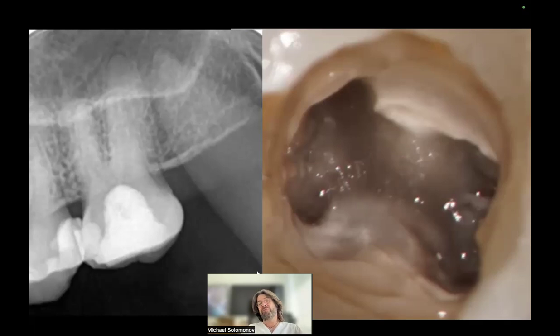The reason for referral was a problem with mouth opening, very limited, about 22, 23 millimeters. This is why the patient was referred to my clinic. And you see indeed a very complex anatomy, unusual for an upper molar. To make it easier for you, I want to show you where the distal buccal and mesiobuccal canals were.